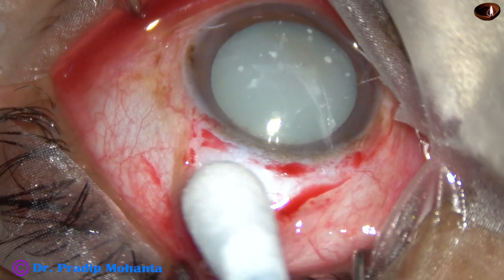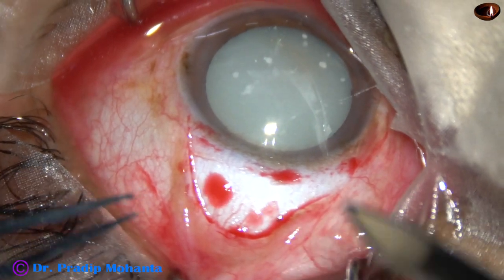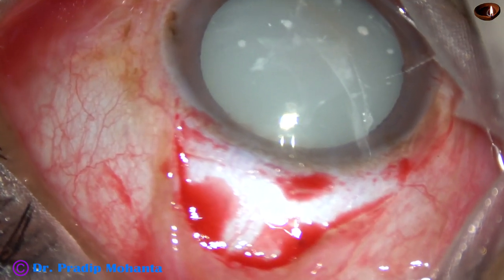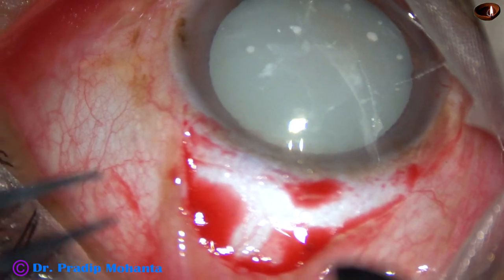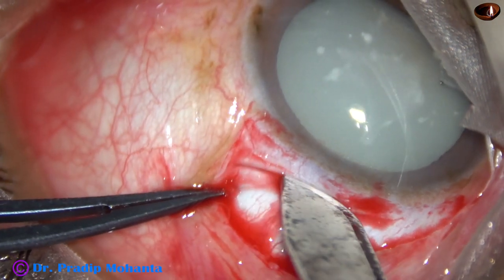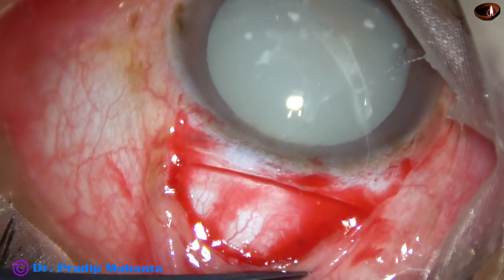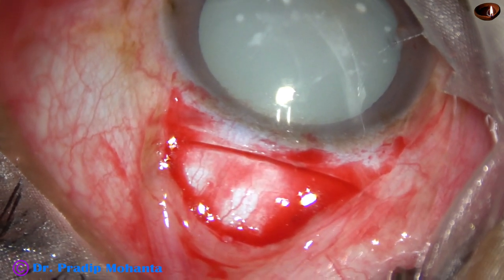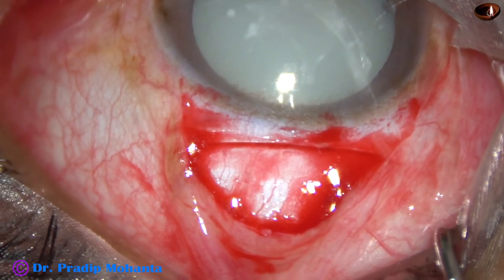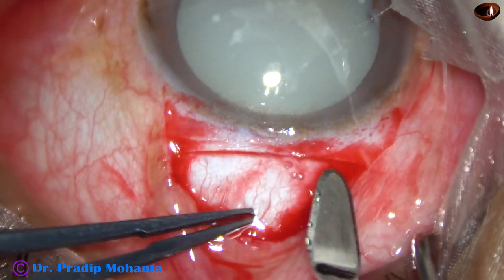Conjunctival peritomy has been done. Wet-field cautery has been completed. And now we are going to make the main incision with a 15-number Bard-Parker blade. This is about half-thickness scleral incision, mild frown incision, not very far from the limbus — about 1.5 mm away from the limbus. And now let us do the tunnel.